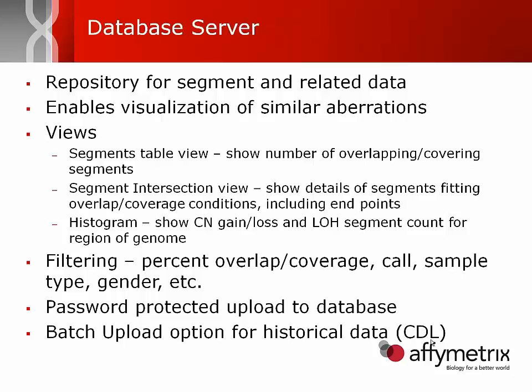We also have an option on our website, a little tool called the ChAS Database Loader, or CDL. This is for all your historic data that you may have been running in Cytoscan over the past few years, or if you have 6.0 data, or maybe 2.7M data, or Oncoscan, and you want to bulk upload hundreds if not thousands at a time. This CDL tool allows you to do that, as opposed to loading a handful in the browser and uploading. It's a way to batch all your data into this ChAS database.